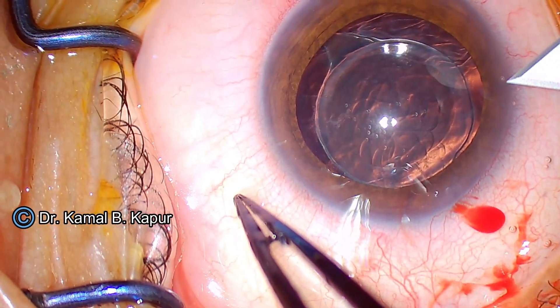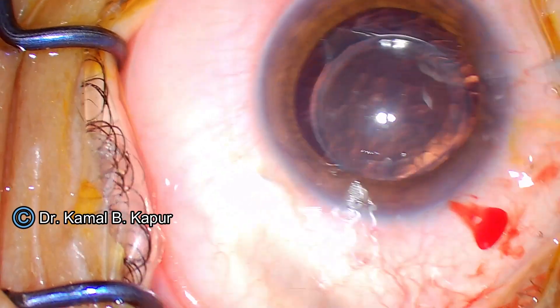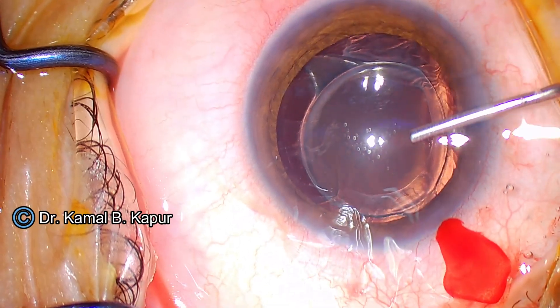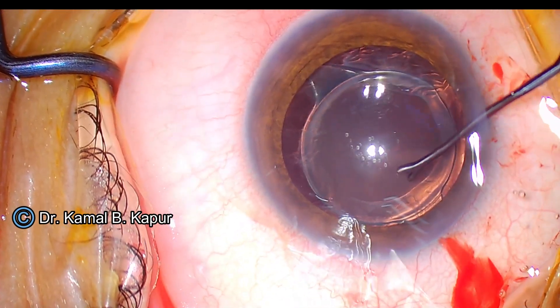It is very important to do this separation before you open the wound, because in case you have not been able to find that demarcation line between the anterior and the posterior capsule beyond the IOL edge, you could be in a tricky situation.